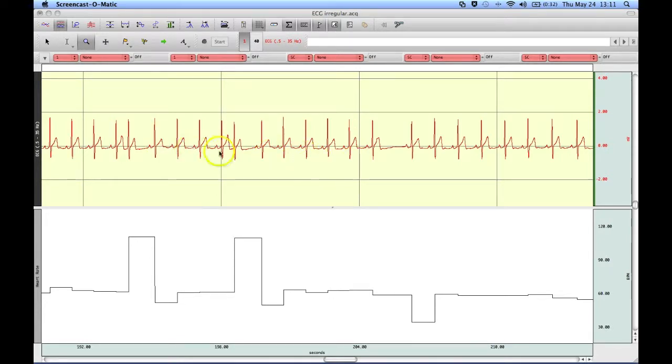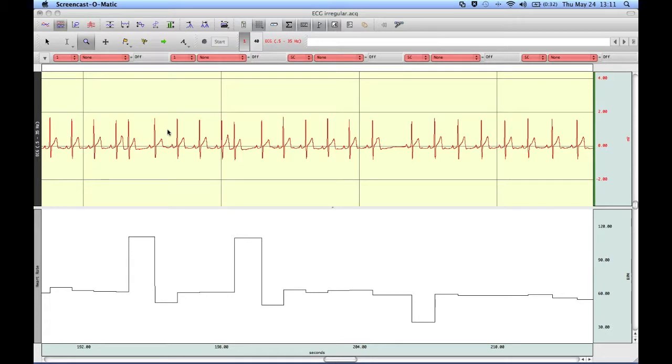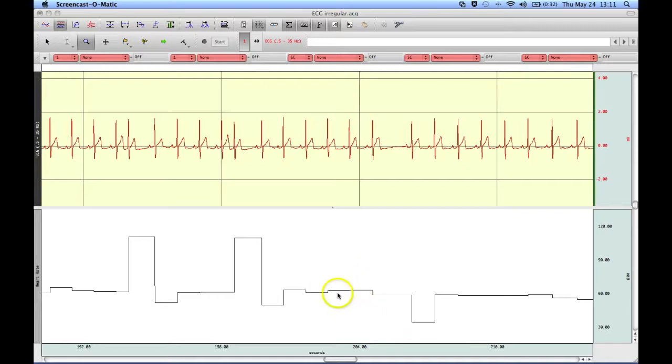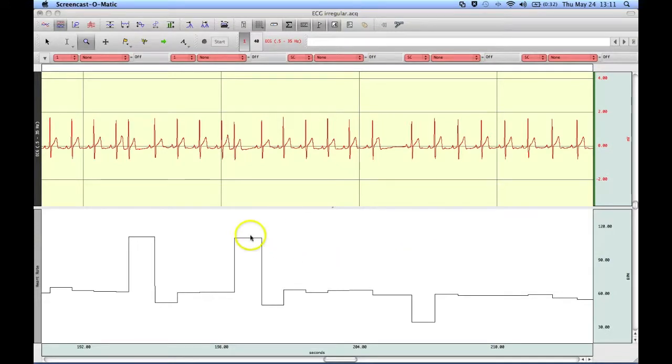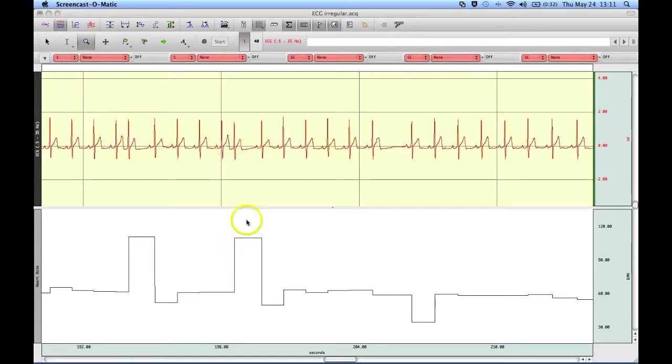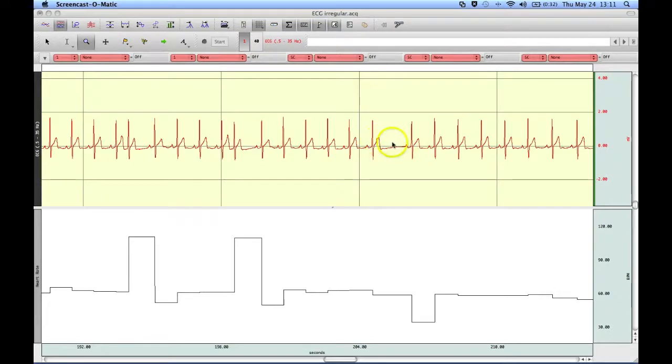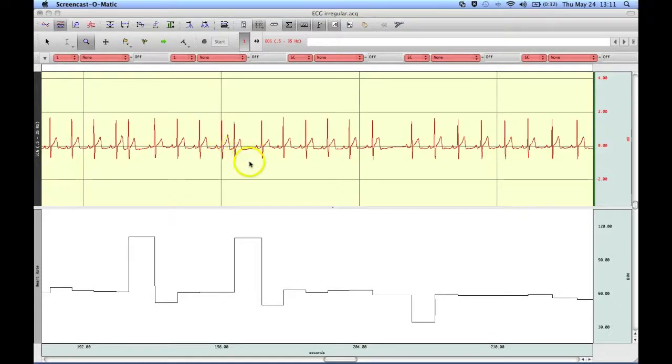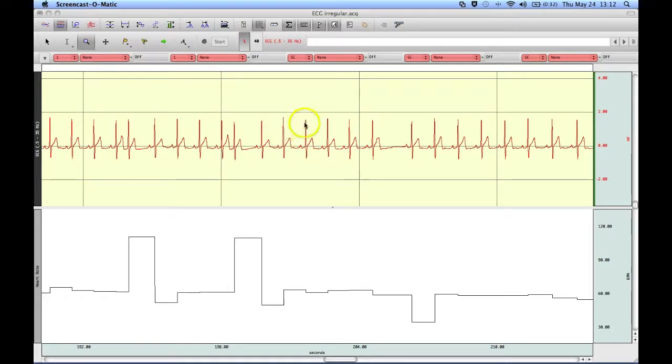Now, I'm going to use this file to try and identify these different events, and I'm going to use the fine cycle peak detector cluster output to cluster or group the ECG waveforms into three different groups. The more typical data that we would see around here, which is about 60 beats per minute, as one group. The second group, the arrhythmia data where the heart rate is, or the R to R interval is much shorter. And then, the third group being the interval, or the longer interval caused by the arrhythmia. So, we'll end up with three groups, and then the software will go through and label each ECG waveform with the associated cluster group number.